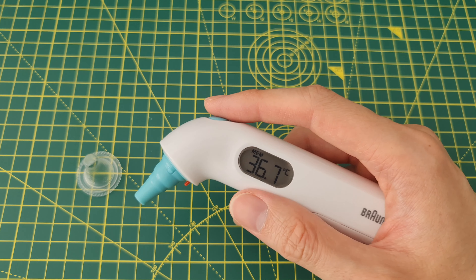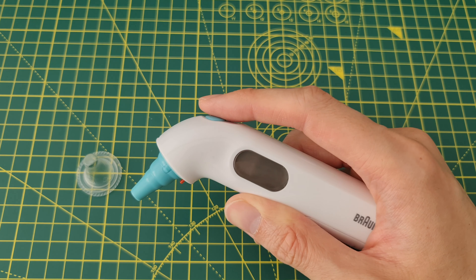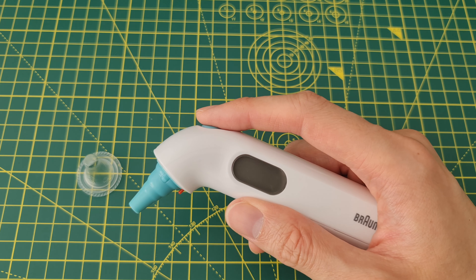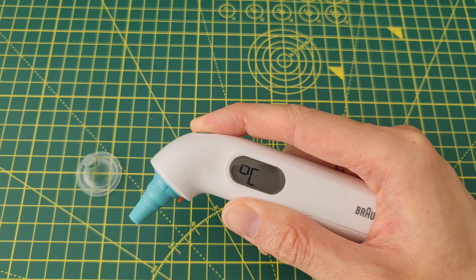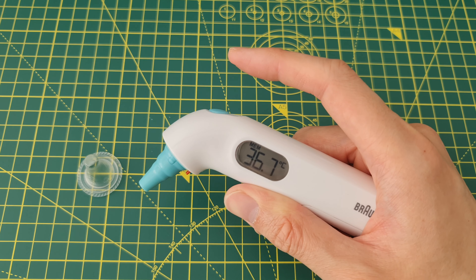You need to hold the button and then it should display 'off'. So in the off mode, you hold it and if you hold it long enough it will cycle through Celsius and Fahrenheit — like so. Celsius, Fahrenheit, Celsius, Fahrenheit, Celsius — and you simply let go and it's set.